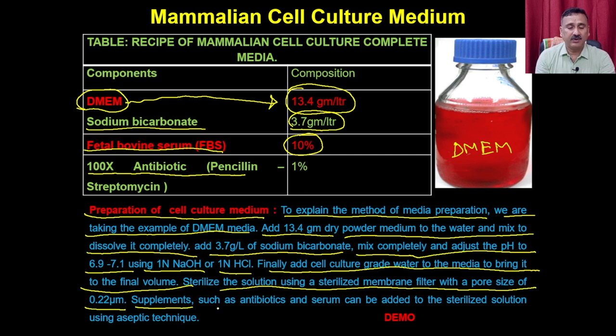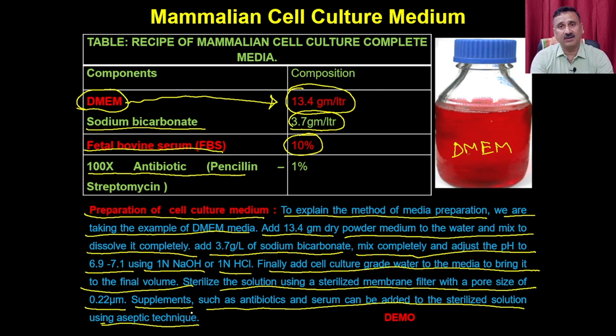Then you are going to add the supplements such as the antibiotics and serum to the sterilized solution using aseptic techniques within the biosafety cabinets. This is all about the theoretical explanations. We have also prepared small demo clips to explain how you can prepare the media within the laboratory or within the biosafety cabinets.